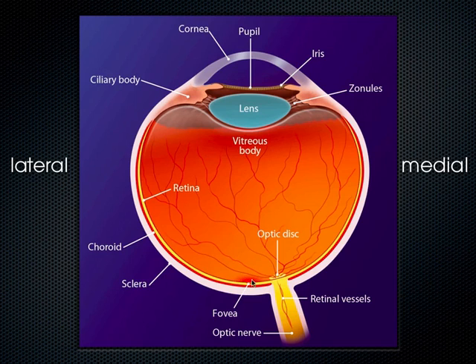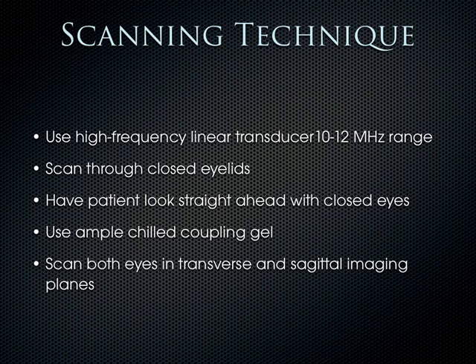And so when you have it still attached at the fovea, but maybe the retina is starting to detach over here, that's a true ocular emergency, and you need to find an ophthalmologist right away to laser this retina back down when it's still attached to that area where the fovea is, sometimes called the macula.